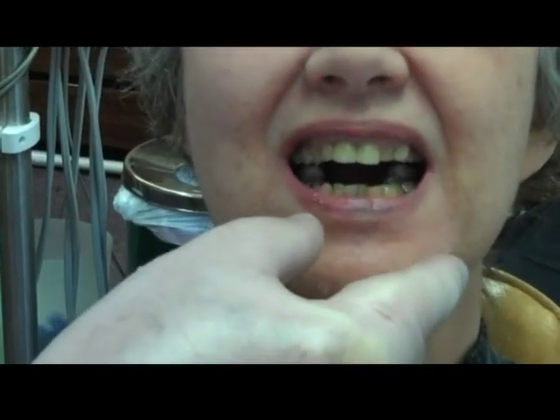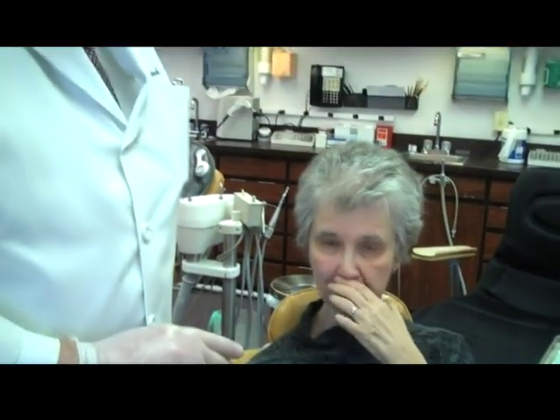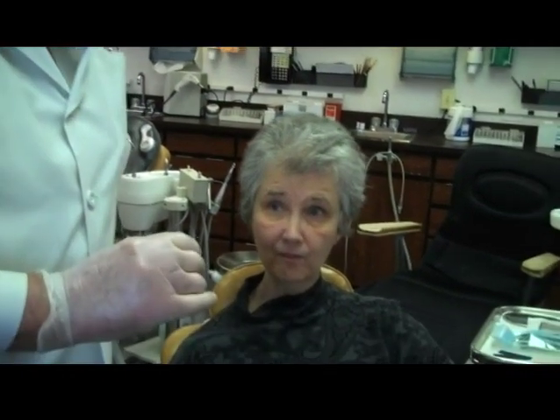Okay. This is the initial position we're going to leave the appliance in. We have balanced the appliance already and it is hitting evenly on both sides. She has one point contact on the left and the right side in the upper first molar area against the flat plane on the left and the right sides of the lower appliance. We are going to see this patient in 3 or 4 days for her first checkup, and we'll show you the improvement between now and then.